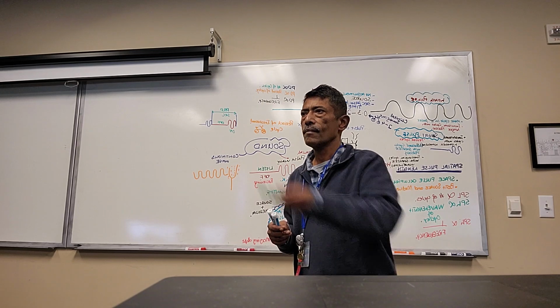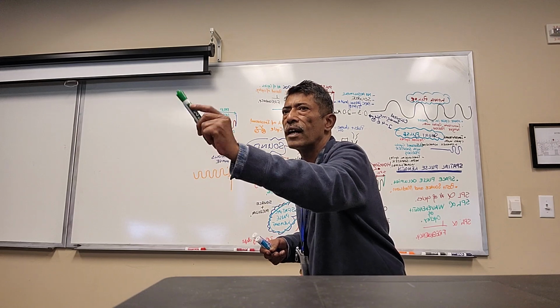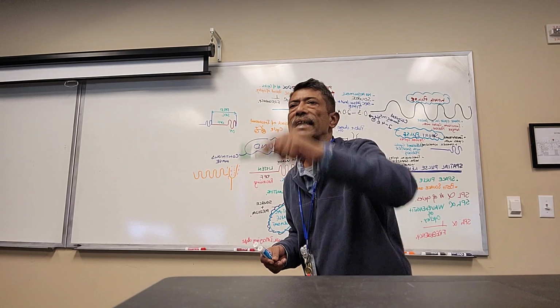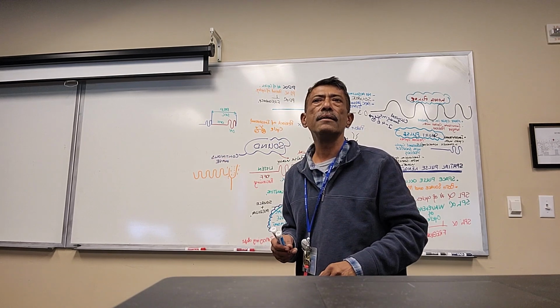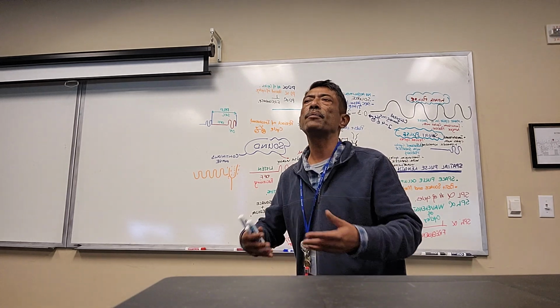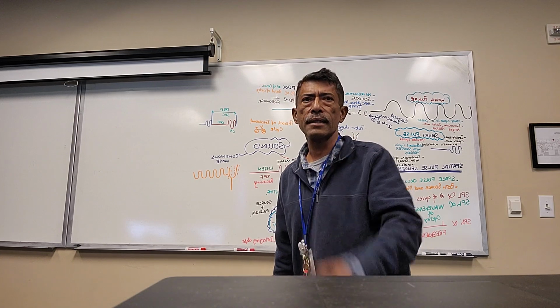The off time? PRP is a combination of both the on and off time. So if one of those two factors is increased, which is the listening time, it will affect the PRP. So longer PRP with structures situated deeper in the body. Shorter PRP with structures situated more superficially in the body.